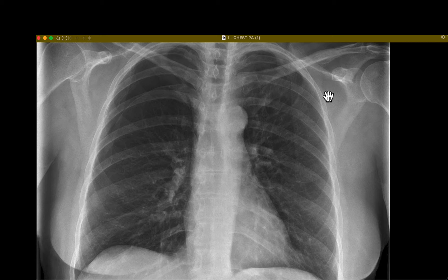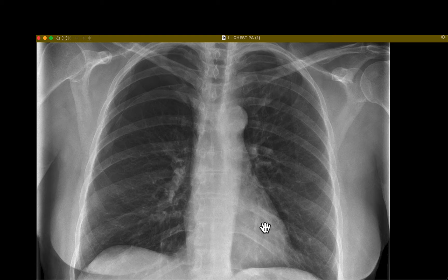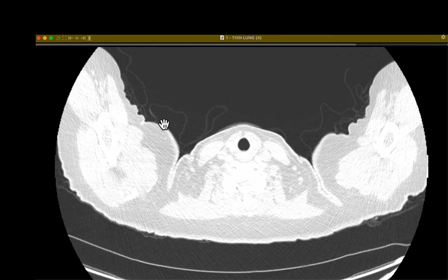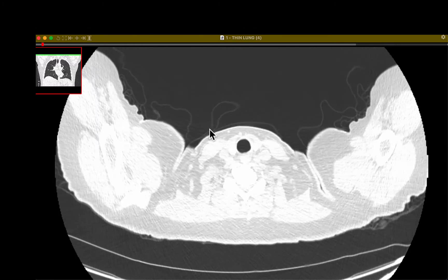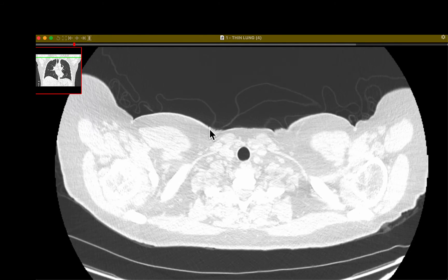The first is a 63-year-old woman who presented with chest pain and shortness of breath. This PA radiograph shows a small right pneumothorax. The underlying lung parenchyma looks normal. She had a pleural drain placed and her symptoms improved, and then she underwent a CT scan of the chest to look for underlying causes of her pneumothorax.